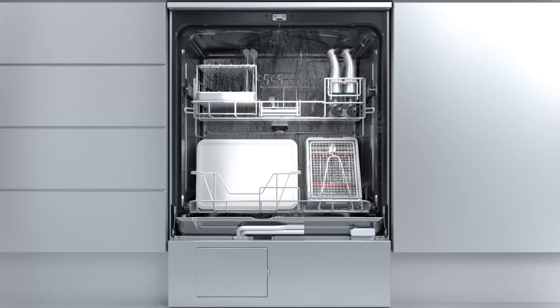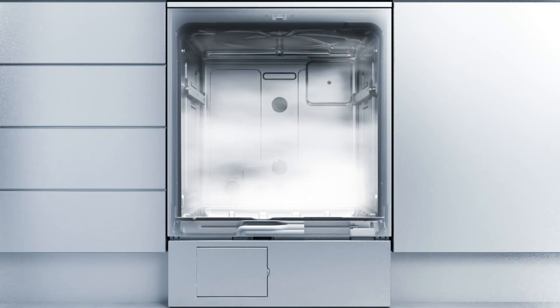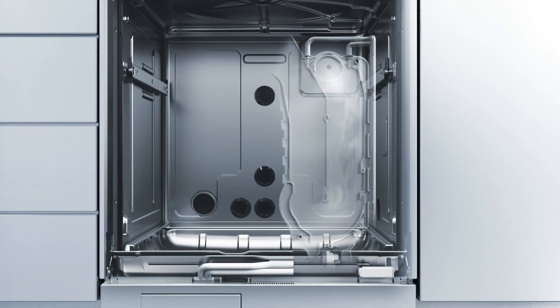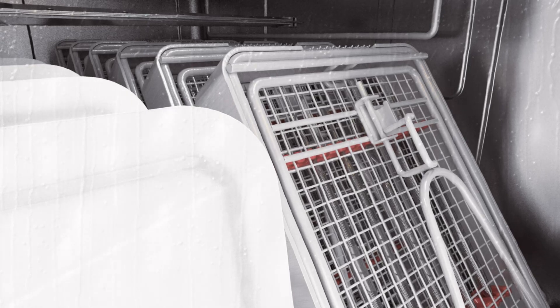The 22 transmission devices or lumened instruments, as well as further load items can be reprocessed in each cycle. These washer disinfectors all feature systems for drying a wide range of instruments after disinfection both reliably and economically. The patented steam condenser located at the rear uses very little water and is highly effective in dealing with steam in the disinfection phase.